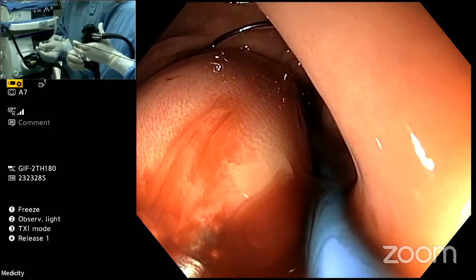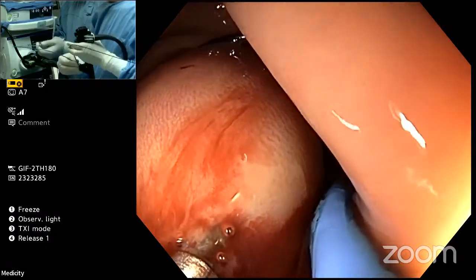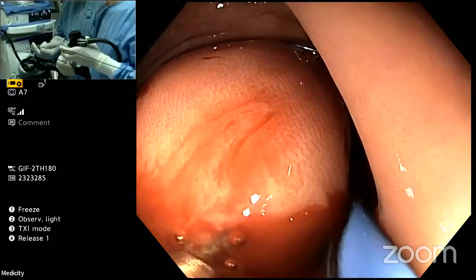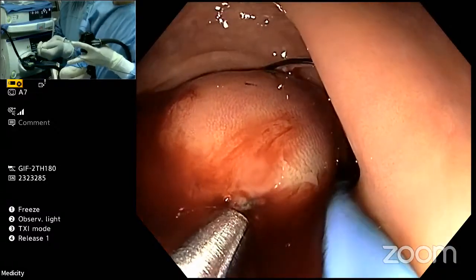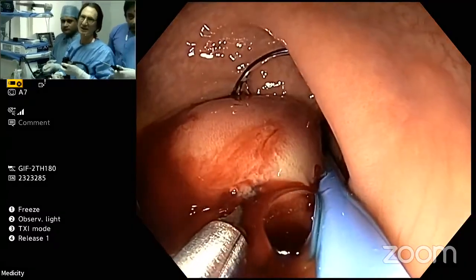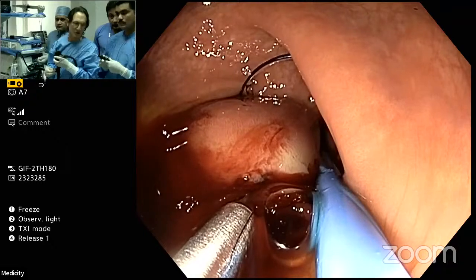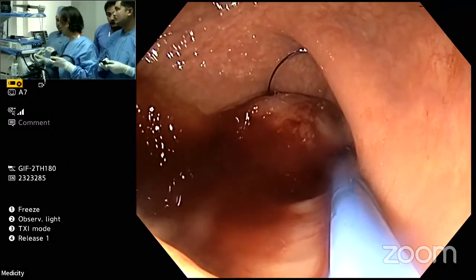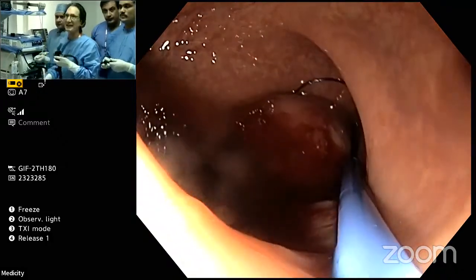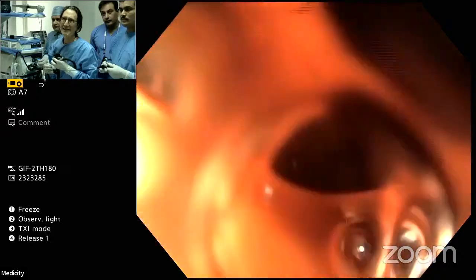And when it's nice and tight, you're going to pull this back again. All right. And when you pull that back and now you push the thumb ring forward, that releases then, and you can release the Ovesco clamp now, please. Yeah, just pull it back. It just will come out. I'm just using this Ovesco three-prong grasper for retraction. It's a retractor. Did you close it? Okay, there. You need to close it. There you go. Okay. So now you advance. Yeah, release now the loop, please. All right. So he's just pushing forward to release the loop. Okay. And let's see if it released.